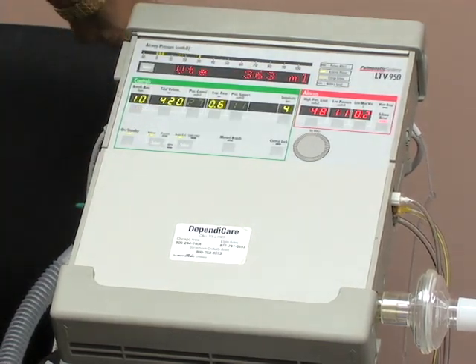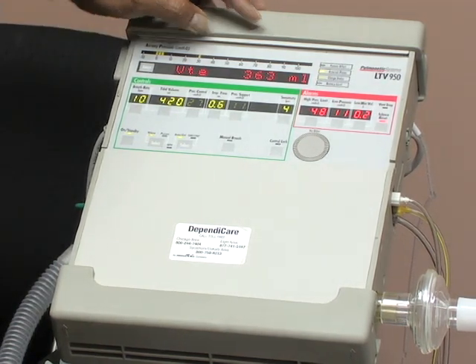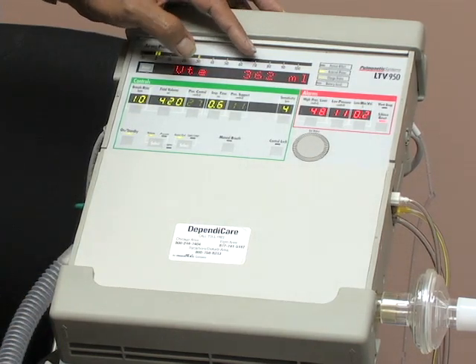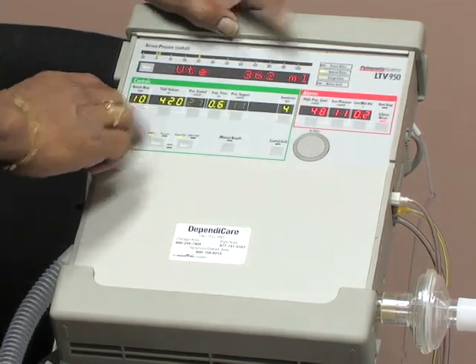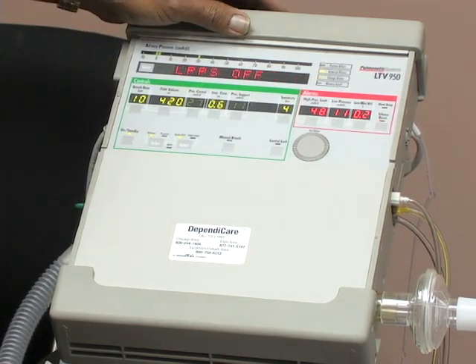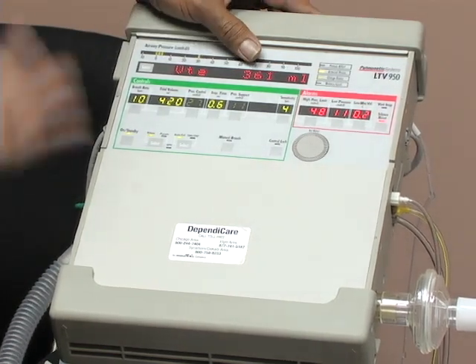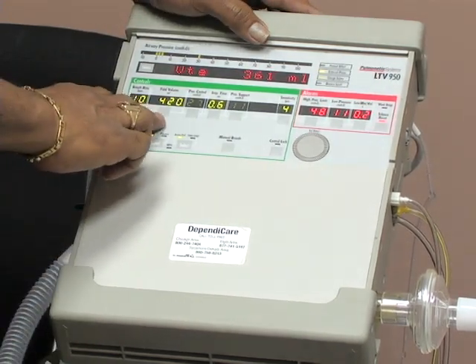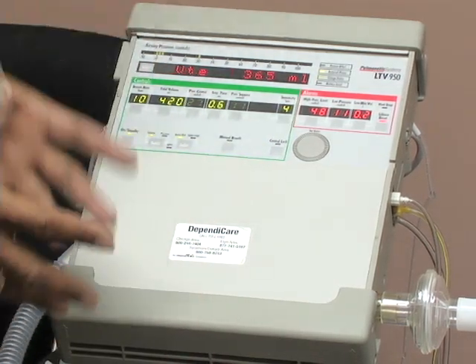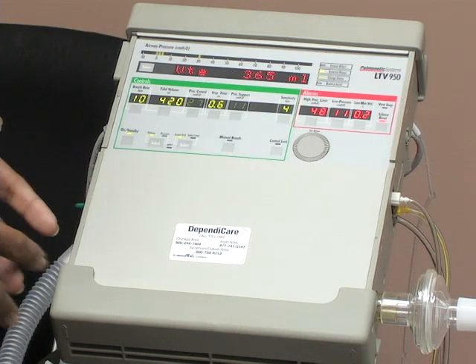We have an artificial lung or balloon that's attached to our ventilator at this time, which does not have the same or consistent lung compliance that a client would, and so the numbers are quite off, but they should be relatively close. Also, when you look at this, what comes out versus what was prescribed to be blown in really shows the difference, or the volume of how much leaked out somewhere on your client.